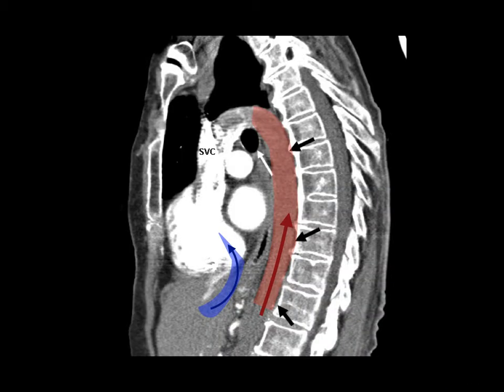So, summary, a very short pitfall. One, don't confuse the IVC versus aorta. Basically, this is a sagittal plane when you do ultrasound. Remember that the IVC is going up to the RA while the aorta pushes down to the patient's back.